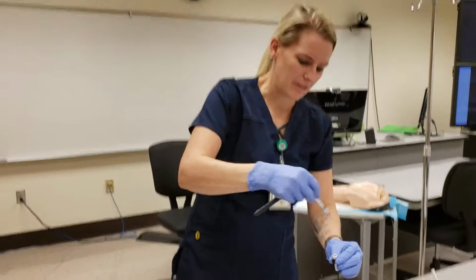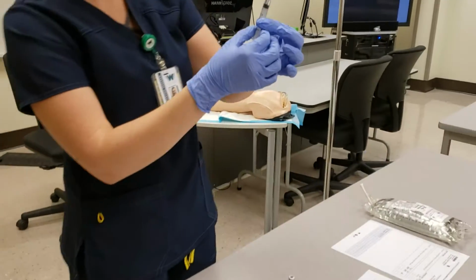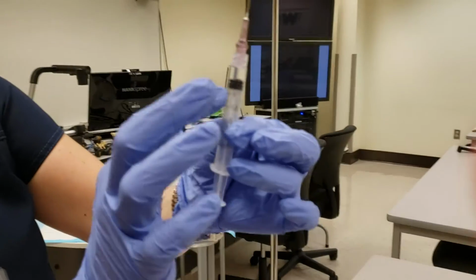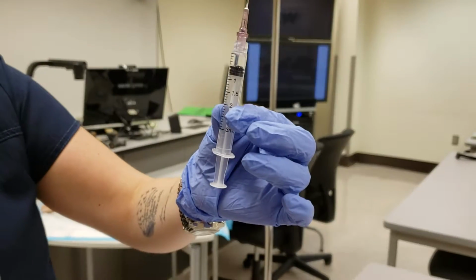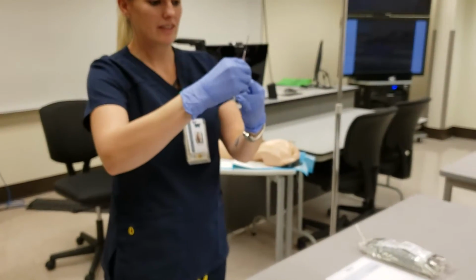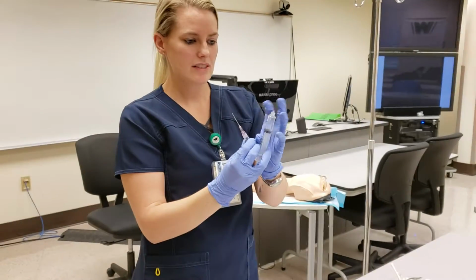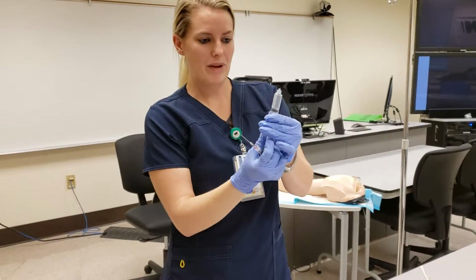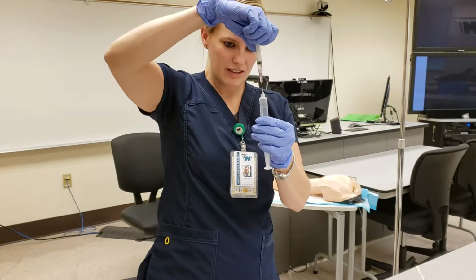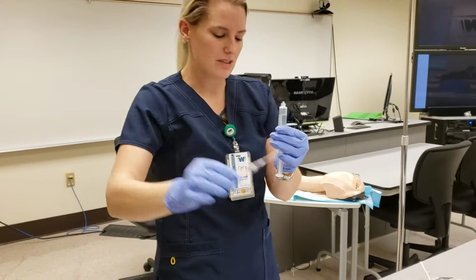So I can pull this out. And just so you can see the 0.5 milliliters there. And then I'm going to put this into this into my, and this will go right into the sharps.